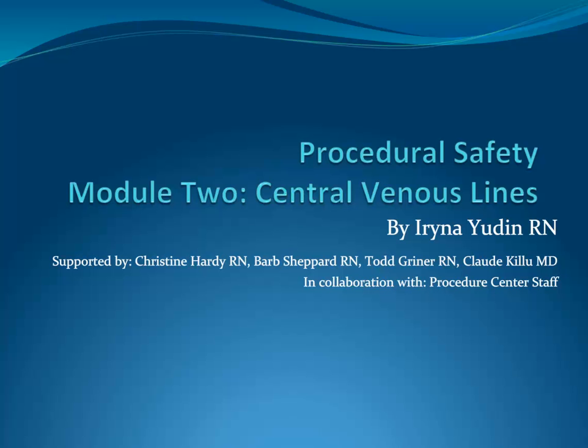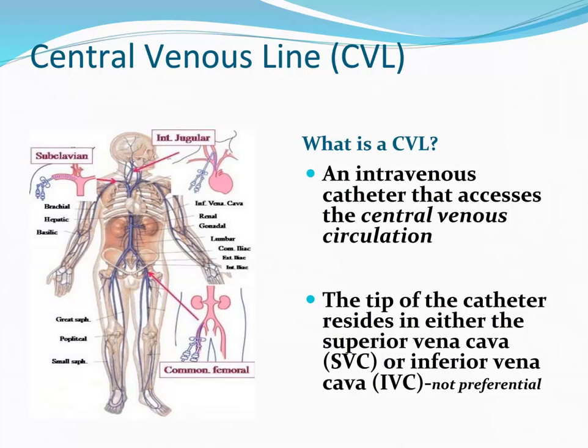In Module 2, we will start getting into procedure-specific content. This tutorial will deal with central venous lines. I think this is the most common bedside procedure we do in the medical ICU. Remember, as we move through this content, to always consider and incorporate the standards of procedural safety in the care that you deliver. So, what is a CVL?